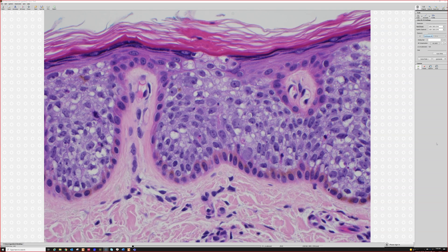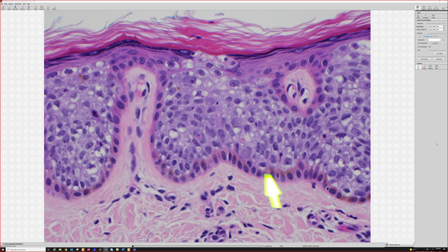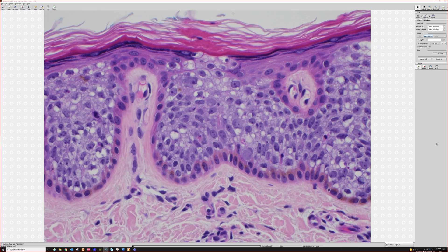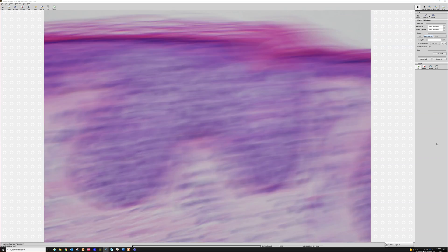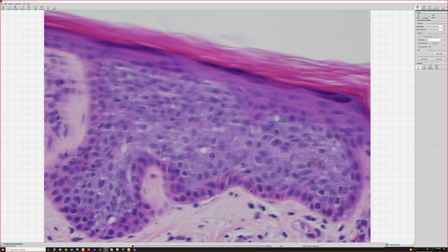The other thing I'm going to point out is that this is honestly probably the best example I have of the eyeliner sign. When squamous cell carcinoma in situ spreads out beyond where it started, it tends to have pagetoid cells in the epidermis and eventually fill the epidermis, but it seems to spare the basal layer. Where it starts it fills the entire epidermis including the basal layer, but as it spreads laterally it leaves that basal layer intact — a layer of basically normal keratinocytes, sometimes with pigment, underneath, with the carcinoma filling the epidermis above.